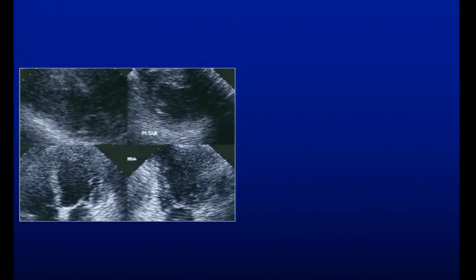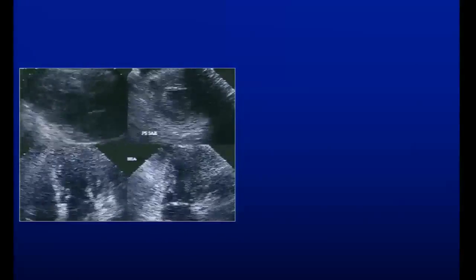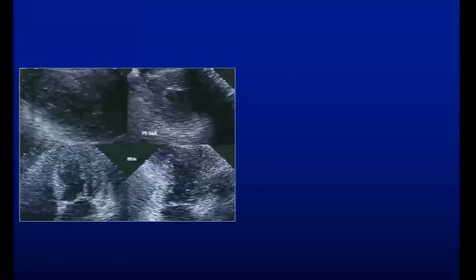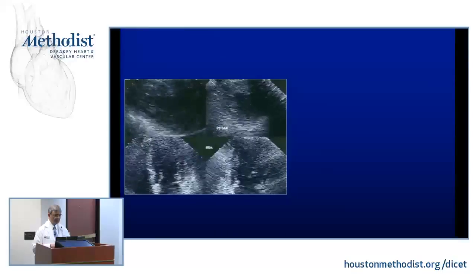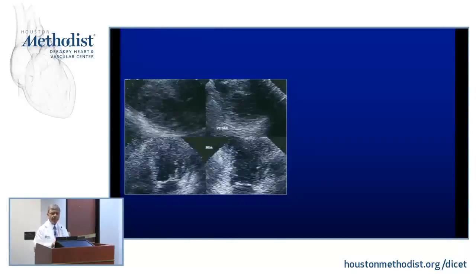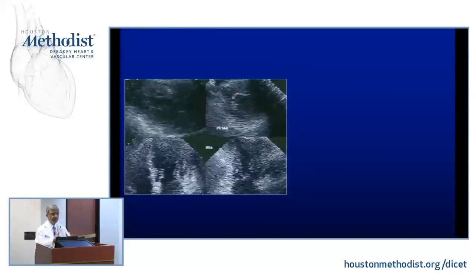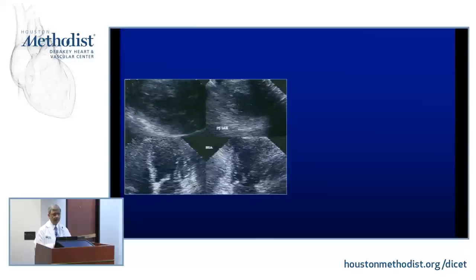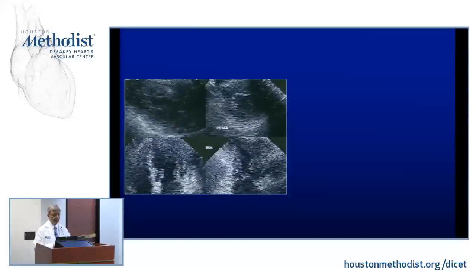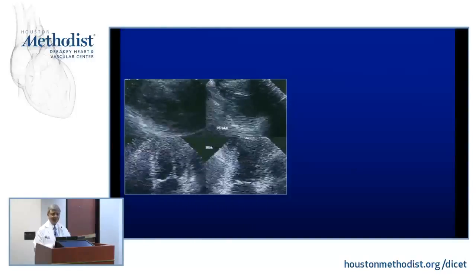In this case, I've shown many times. I still like to show it because it just reminds you that at times it could be very localized. I interpreted this study as normal. It was before digital. And these are the best views that you can get. So interpret... it could be that this is completely normal.